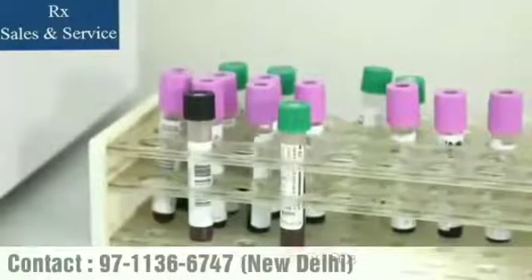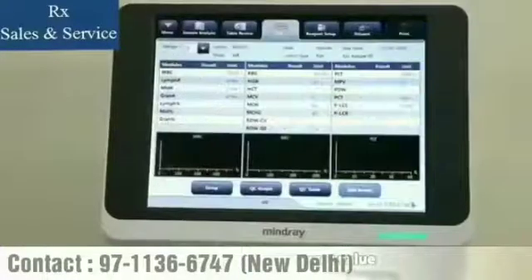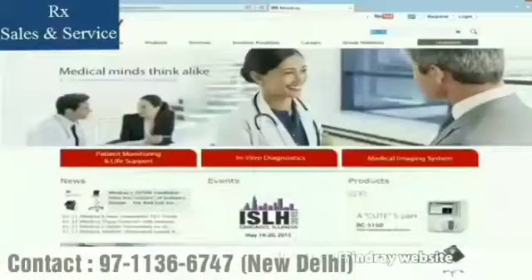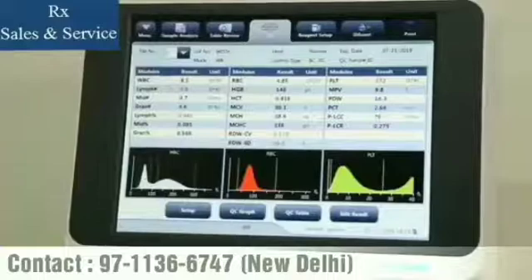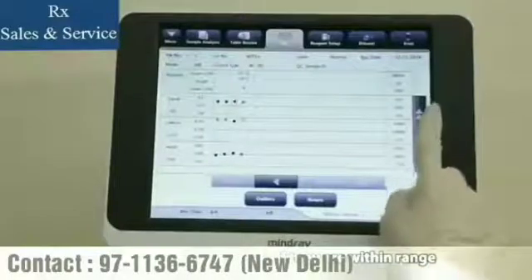BC3D is the QC material for BC-30S. Its shelf life is three months, but you must use it within 14 days after opening. After importing the QC file, BC-30S can automatically load the target value, lot number, expiration date, and level of QC. You can download the QC file from the Mindray website or get it from your local Mindray representative. Run the QC through the sample probe in QC mode after mixing well. You may review the QC results in the LJ QC graph to confirm they are within range.